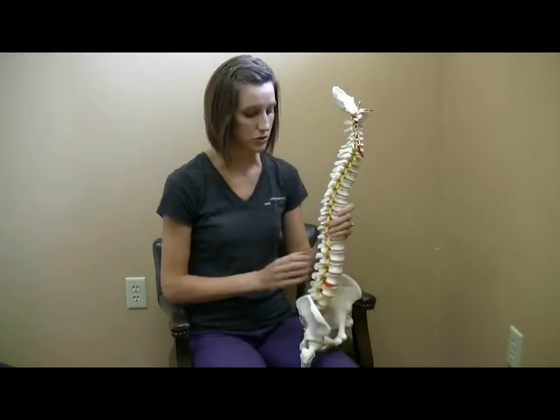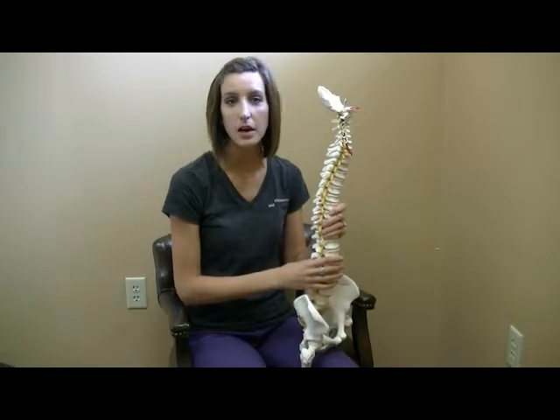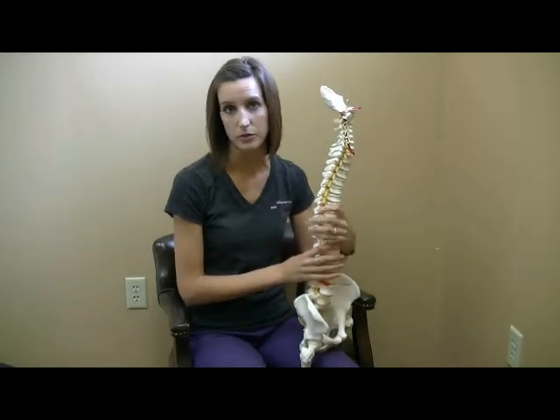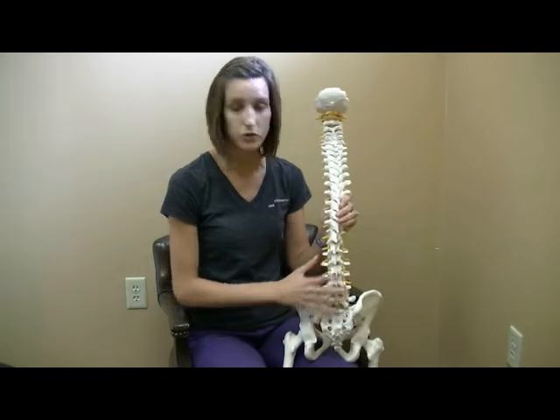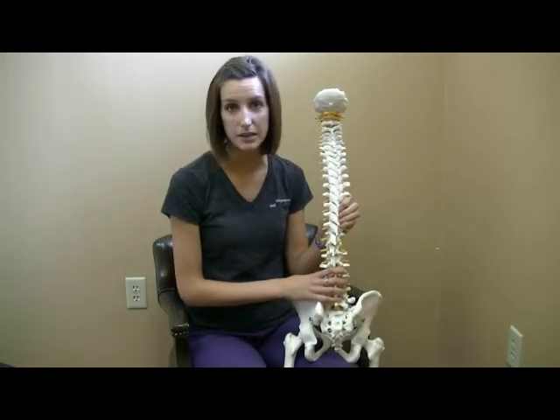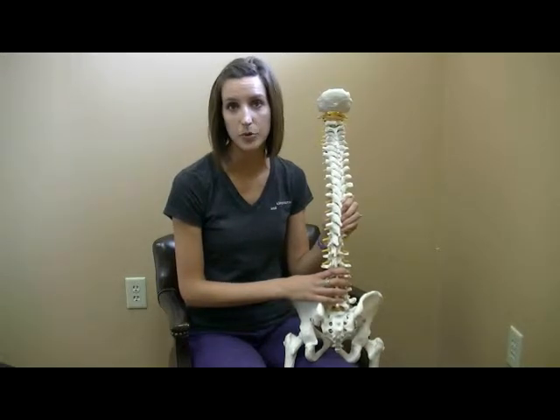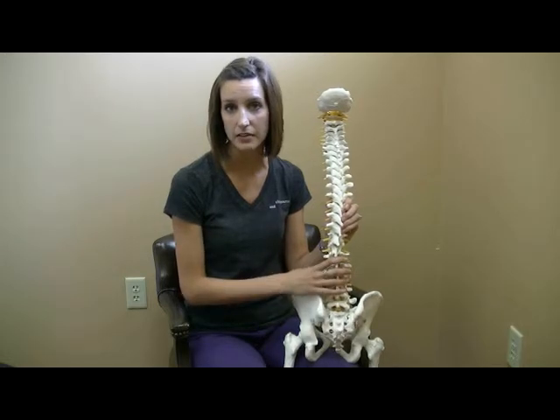We like to usually see the grade of arthritis because that also helps me give patients a better idea of long-term what to expect as far as progress goes. But I want to talk about the hips a little bit. You do not see bursitis, tendonitis, those types of conditions on x-ray, but we can almost always tell that pretty easily based upon a history with the patient or based upon a hands-on exam.